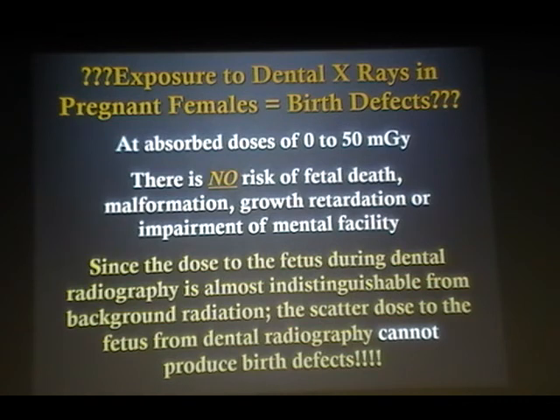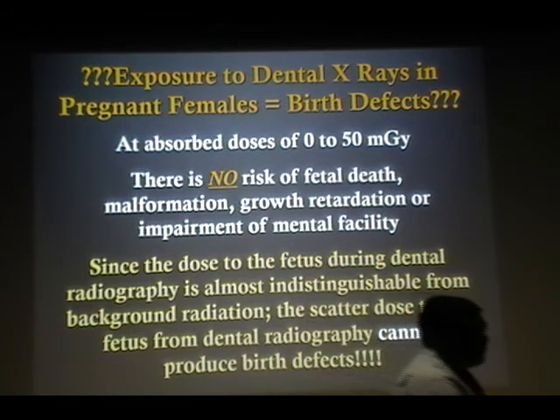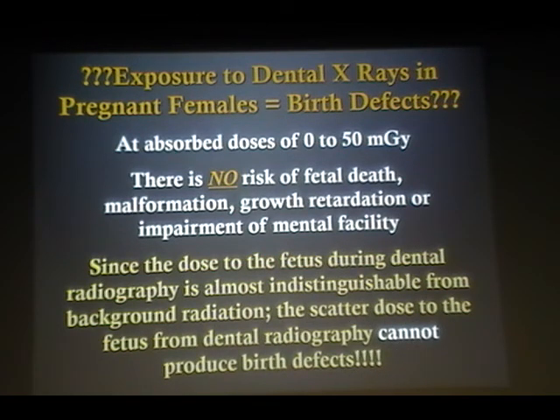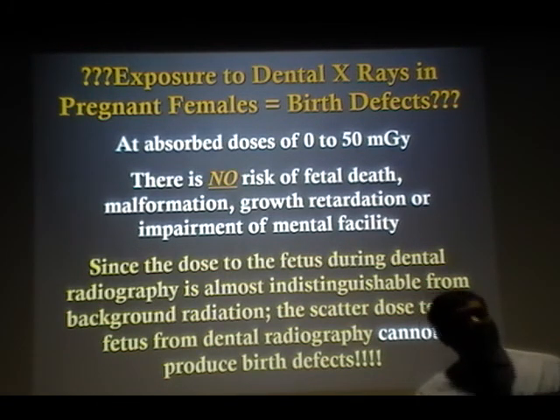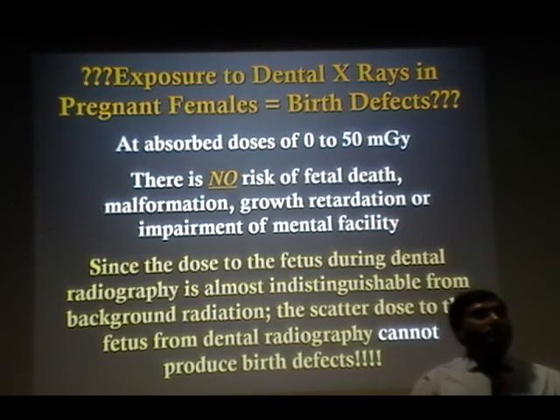If they're really concerned, you could put a lead apron on and then take a picture. If the patient does not want a radiograph, that's also fine, because you have to respect that as well. So we know that scientifically there is absolutely no contraindication. This is not just what I'm saying. It's approved by the ADA, FDA, and American Pregnancy Association.